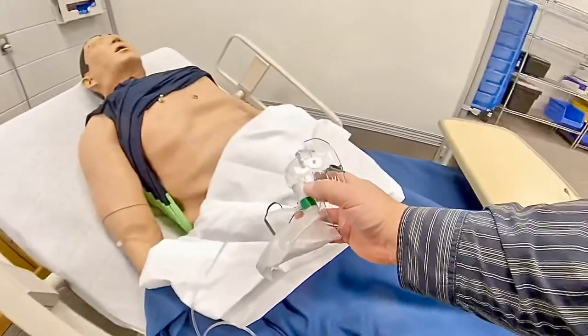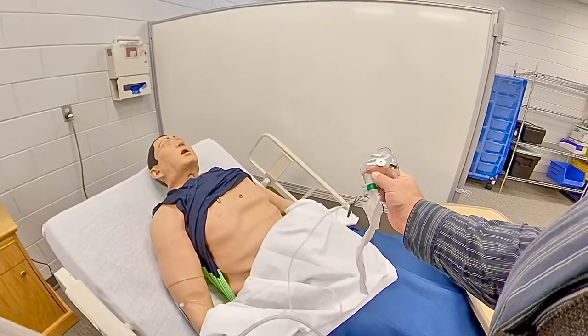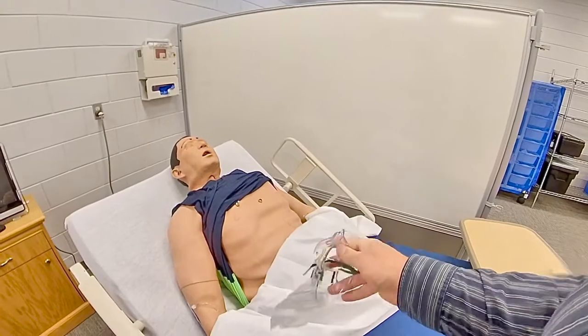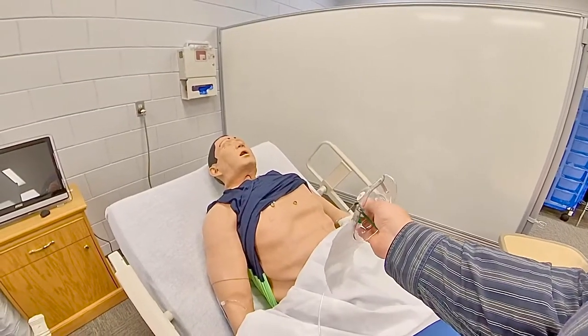Now, when I look at the mask, I should begin to see it inflating. To get this to inflate completely, I take my thumb and put it on the inside there to close off that port.